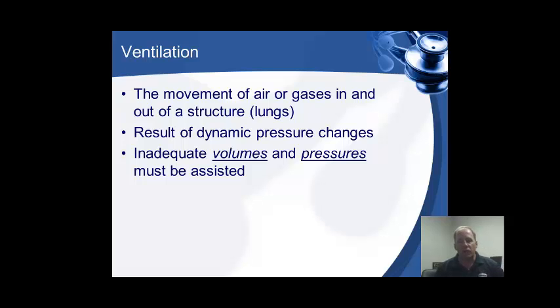Now ventilation, like the room you're in right now, it's being ventilated. It's not necessarily being oxygenated. Ventilation is just moving air in and out. It has to do with volumes and pressures. Okay, we're going to control those volumes and pressures with our ventilator and have targets that we're going to shoot for and volumes that we're going to apply to patients based on their weight off of a chart and ideal body weight.